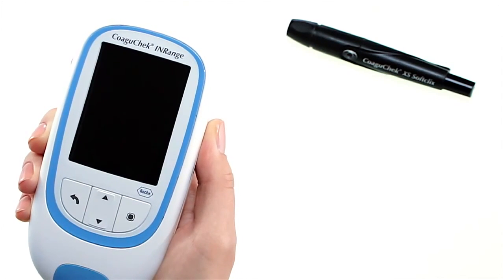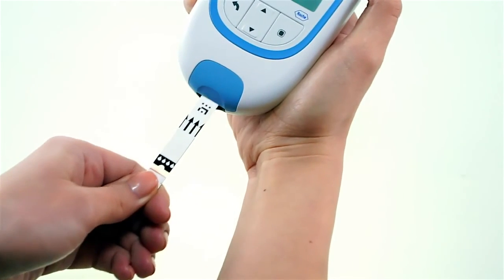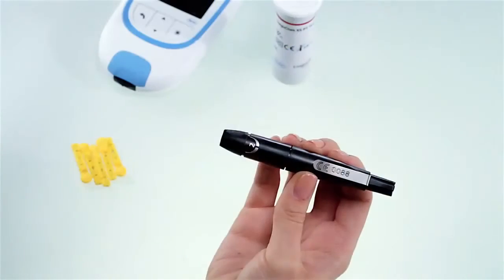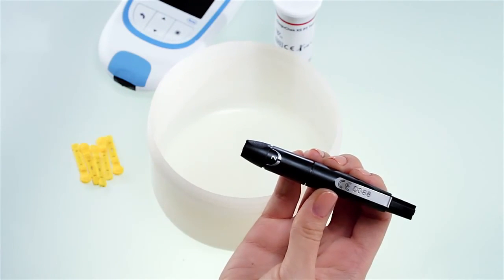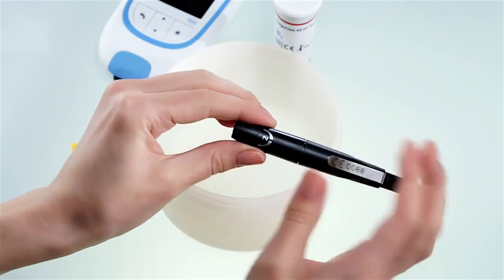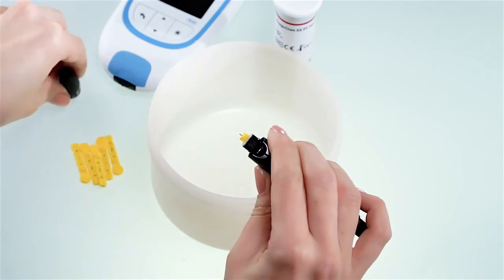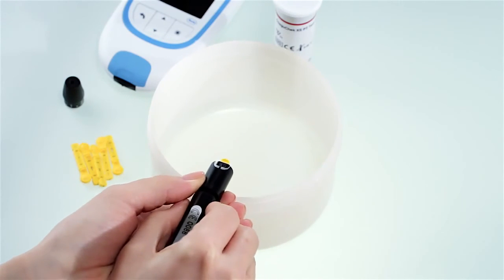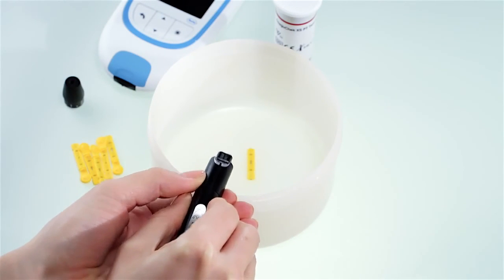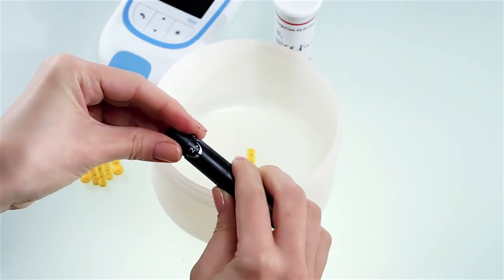Now, two important final steps. First, dispose of the used test strips in your regular household waste. Then, carefully dispose of the used lancet so that it cannot cause injury to yourself or others. Use a sturdy sharps container with a lid. Remove the cap and point the lancing device into the sharps container and slide the ejector forward as shown. Then place the cap back on the lancing device.